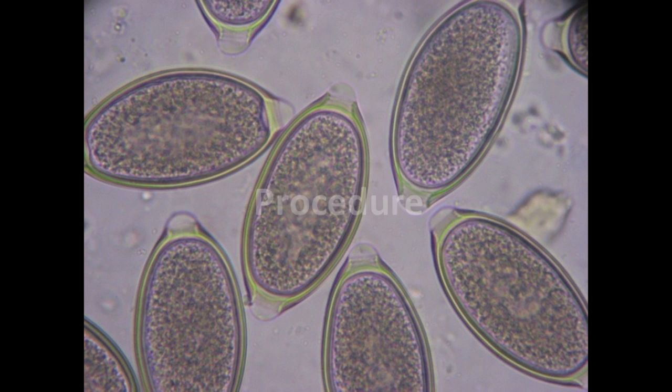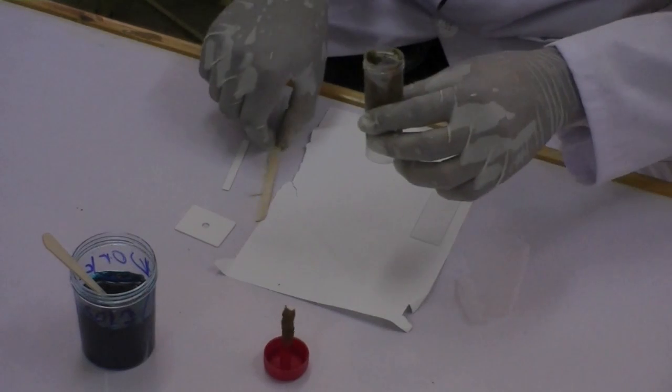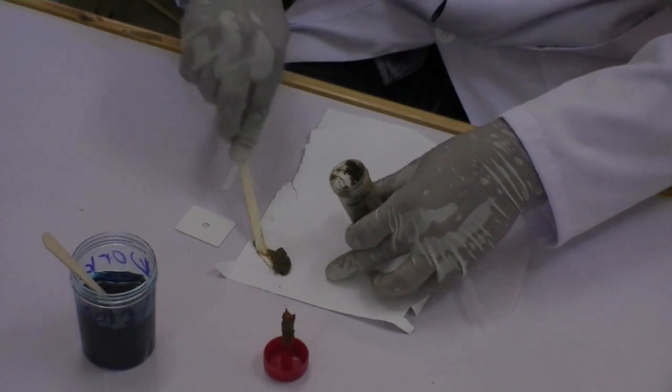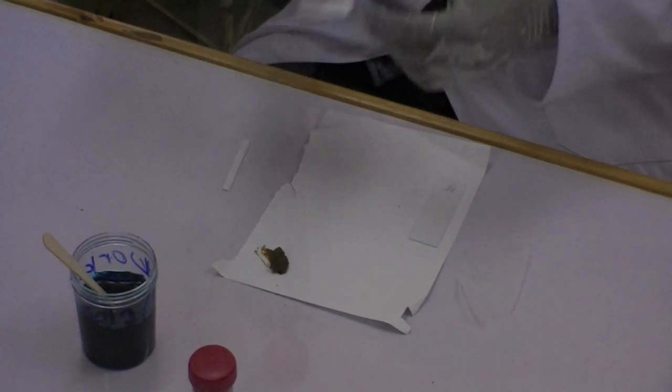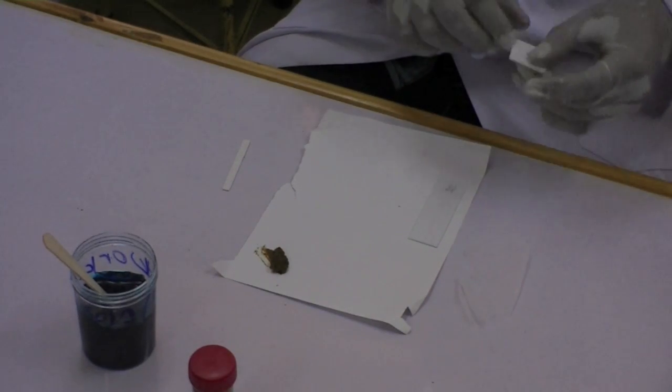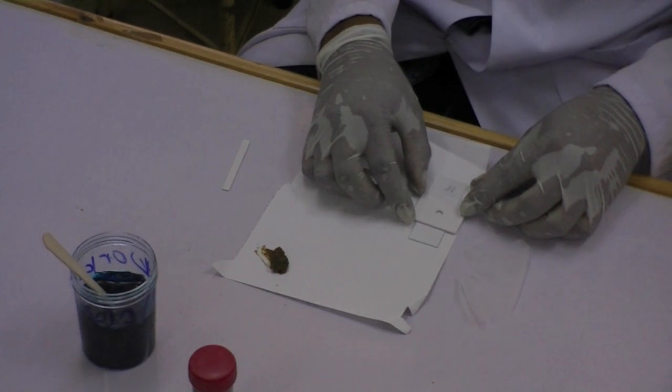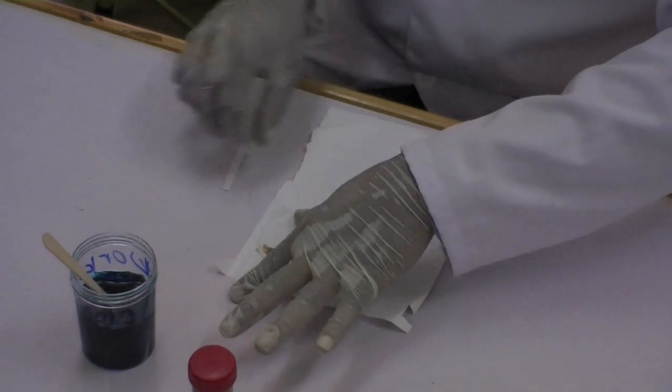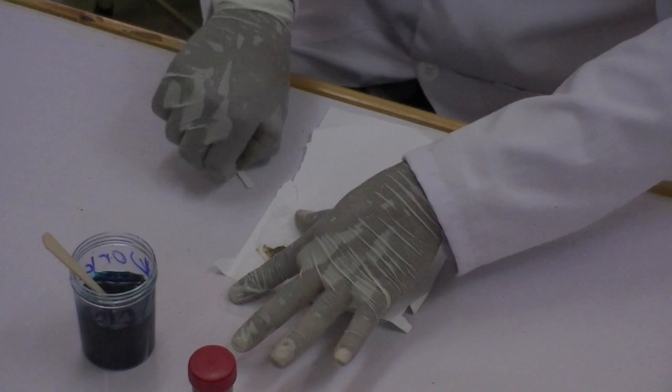Procedure. To start, place a small mound of a stool sample on the scrap paper. Place the template with the hole on the center of a microscope slide. Afterwards, press the small screen on top of the stool so that part of the stool is sieved through the screen and accumulates on top.